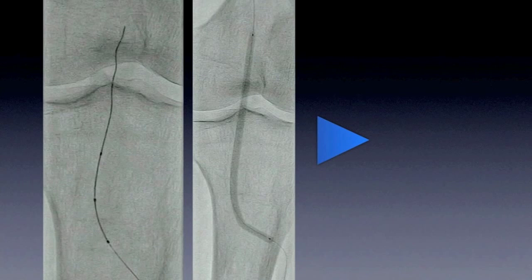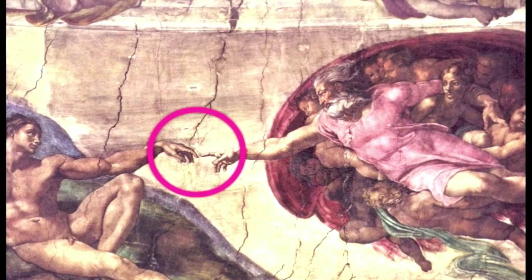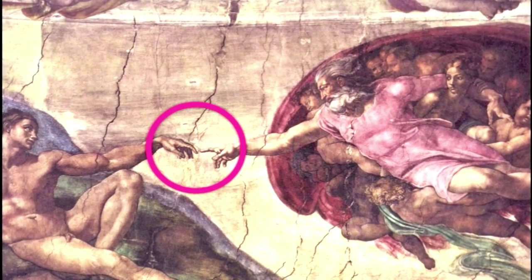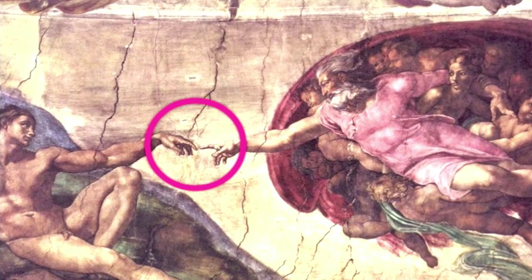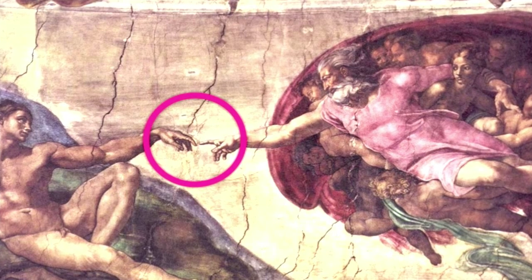Put the wire in a retrograde fashion, use a micro balloon, and your angioplasty is done. Although normally it's easy to find your path, sometimes you'll find yourself trapped in a dissection plane. This piece of art describes the Michelangelo technique, where two wires come from above and below in an attempt to find each other. This is a complex case we had, where there was a wire from above and below, but we unfortunately couldn't find our path — we couldn't connect the two dissection planes.